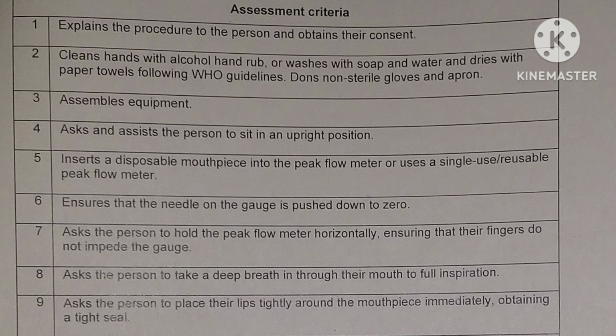There will be a chart available, so you can verbalize, this is your expected peak flow. Then we can ask the patient, and if they need any assistance we can make them sit in an upright position.